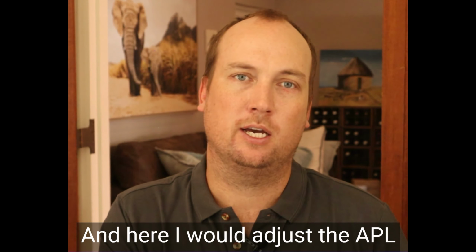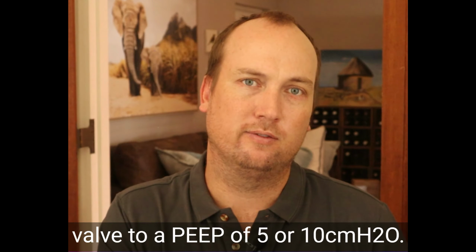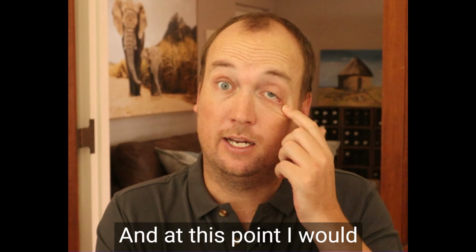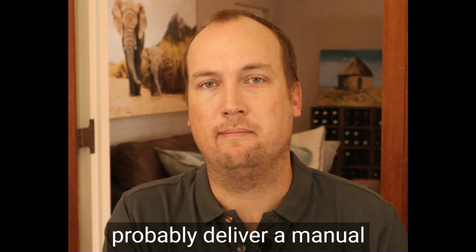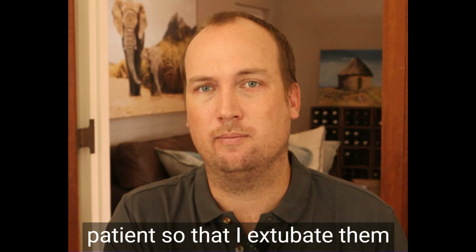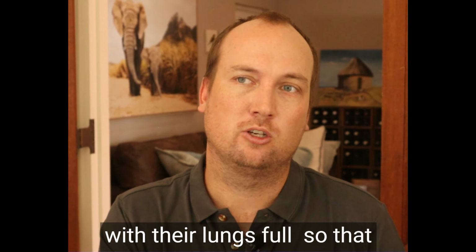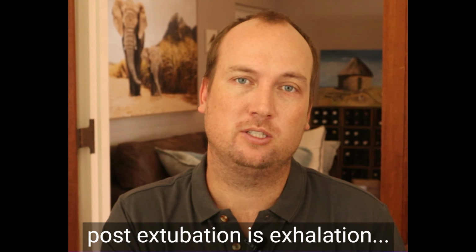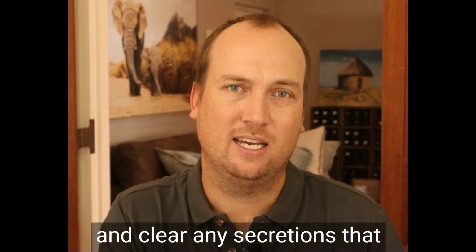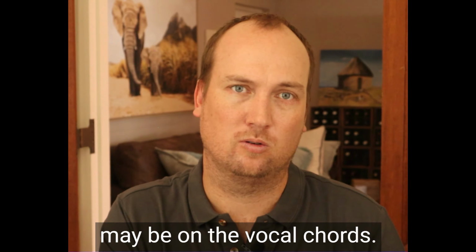And here I would adjust the APL valve to a PEEP of 5 or 10 centimeters of water. And at this point, I would probably deliver a manual positive pressure breath to the patient so that I extubate them with their lungs full, so that their first ventilatory movement post-extubation is exhalation, so that they can cough out and clear any secretions that may be on the vocal cords.